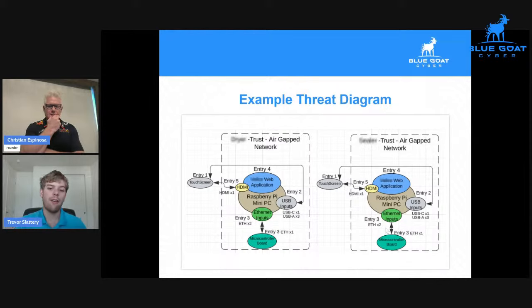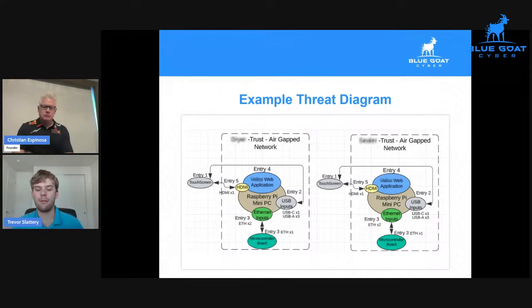Of course, we want to make sure that everything is secure. So testing under the assumption of, what if you get into the trust boundary? Things of that nature always need to be considered.